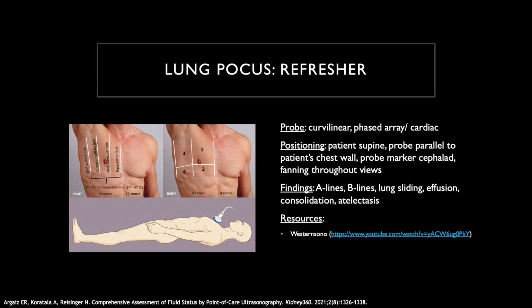Once positioned, the clinician fans the probe to assess the lung parenchyma. Listed here are some of the findings we'll be looking for, and we'll discuss these shortly. For a more dedicated resource on an approach to lung ultrasound, there's a link to a Western Sono video coming from the ultrasound community at Western University.